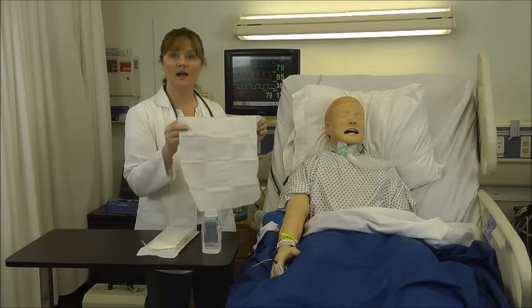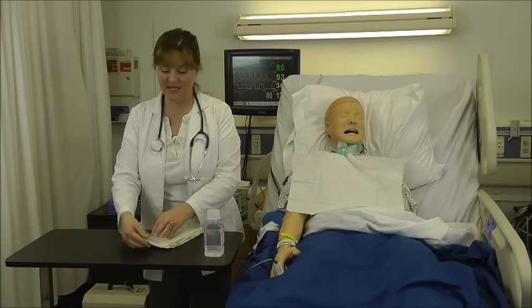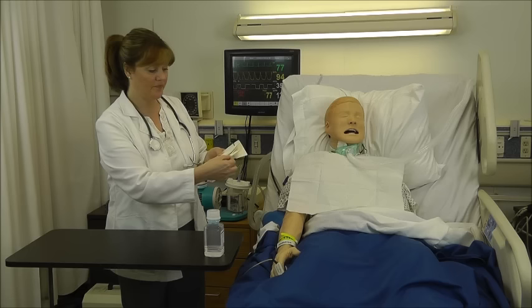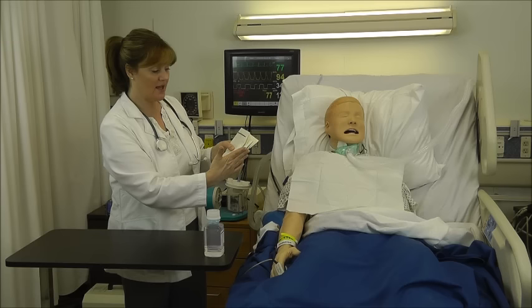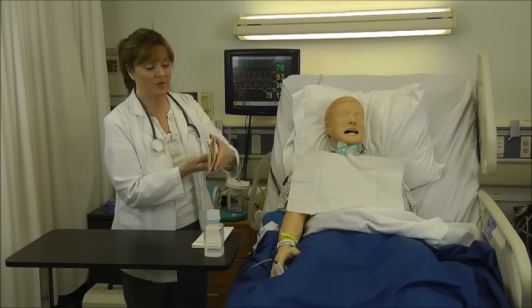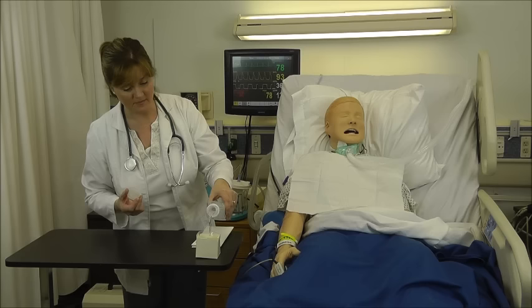I'll set the drape across his chest to protect it from secretions. And I'll take out the catheter kit. The way this package comes, there's a box tucked right inside the envelope. And the part of the box that's outside is the part that I can touch, because it's the part that will go against the table. So I remove it carefully, not touching the inside. That's the part that needs to stay sterile. And I pop the box open so that it can hold the normal saline. I'm careful not to touch the box as I pour the saline in. And I'll set that to the side.